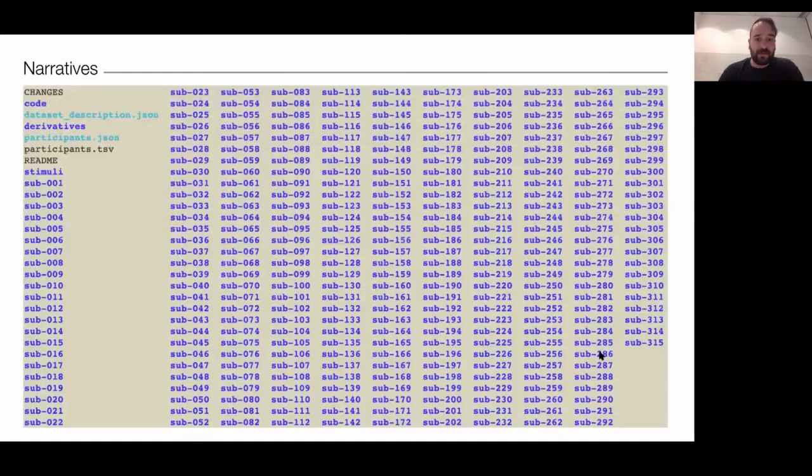The other thing that's nice about this is it's a bigger data set, a much heftier data set to show you the capabilities of this. And what I find completely amazing is that you can point something like MRIQC to this directory that contains all of these subjects and just say go, and unless you screwed up the command somehow, it can just understand how to do quality control on this data set with essentially no further input. You just say MRIQC subject one for me, and it reads all of the metadata out of those JSON files. It decides whether it needs to do this or that kind of processing step, and gives you the QC results.